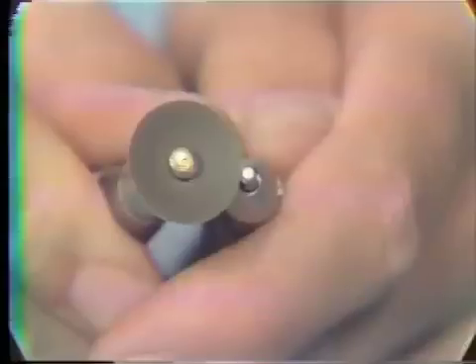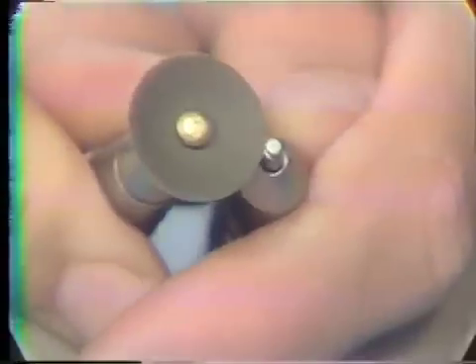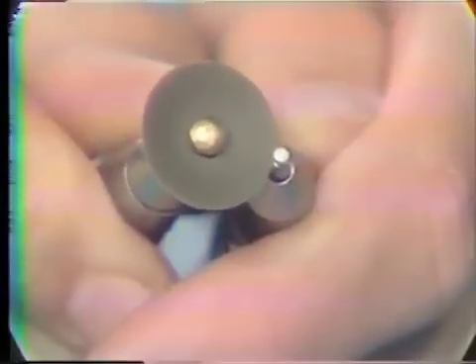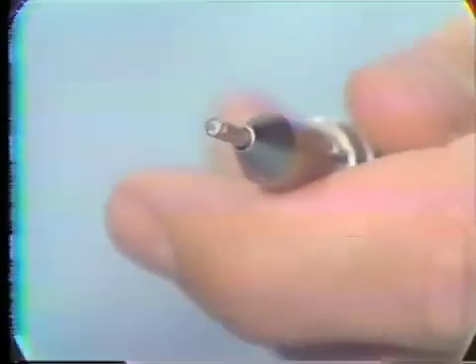Both electro-torques are rotating. Now the gauge goes through, but it's a little tight. So I will take a little bit more off, and then we'll move to our next step.